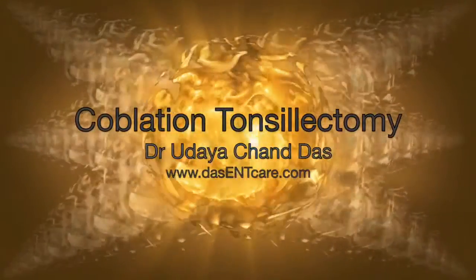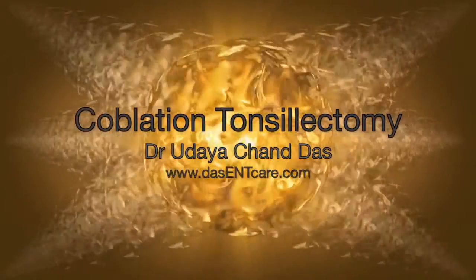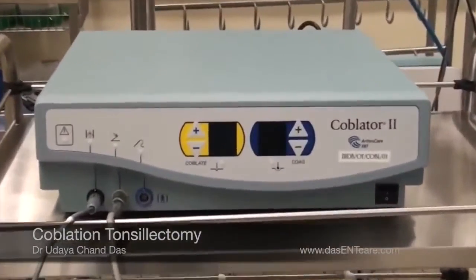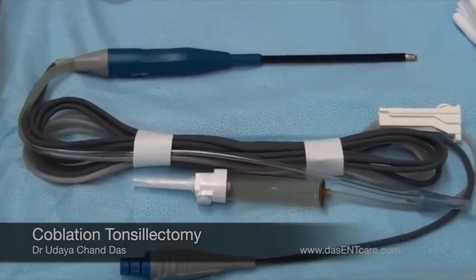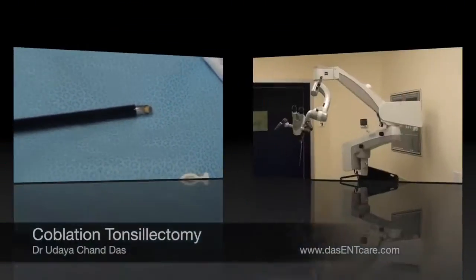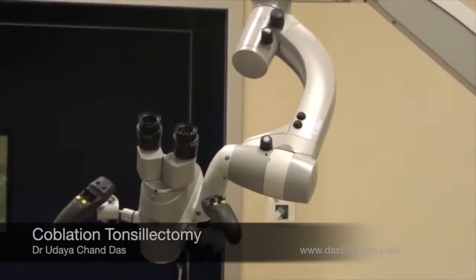Hi, this is Dr. Das, and today I am presenting this video of a coblation tonsillectomy. Coblation is by far the most recent advancement in tonsil surgery. This is the machine, which is called Coblator 2. This is a wand — this is an Evac Extra 70, which is used for tonsillectomy. This is the microscope; I normally use a microscope for this surgery.